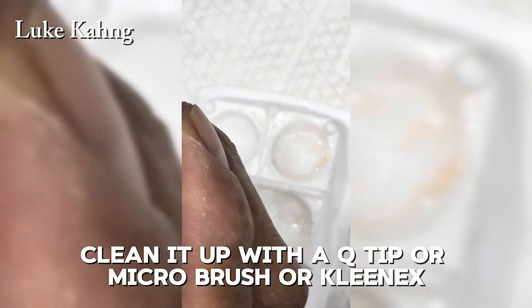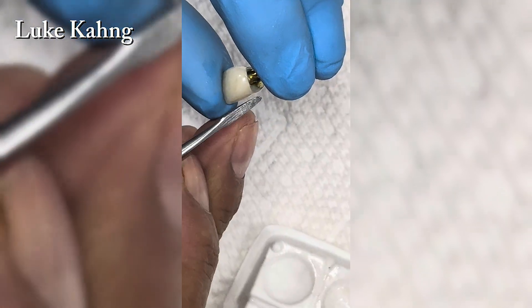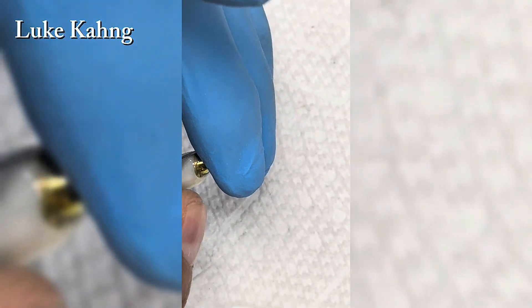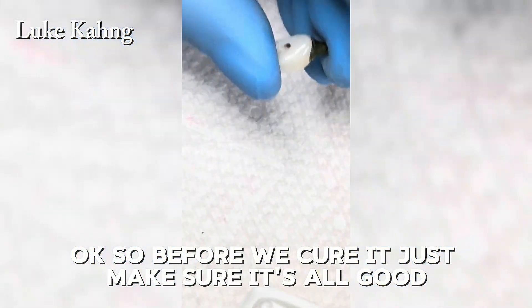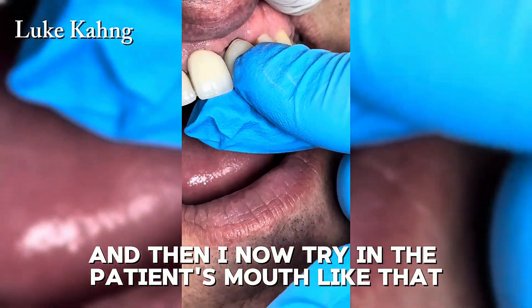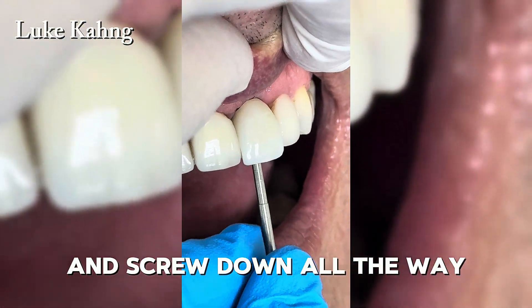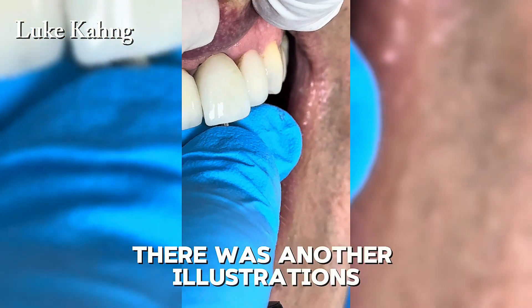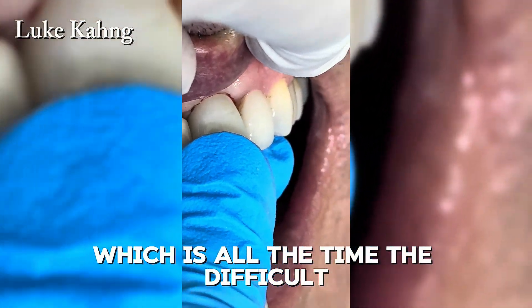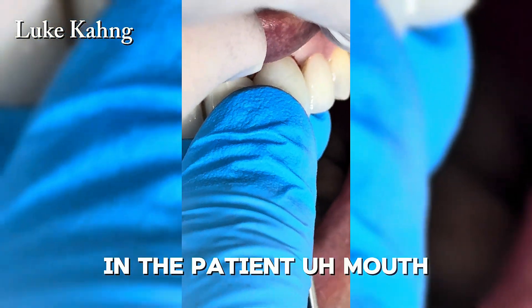Clean up the excess cement with a Q-tip, microbrush, or Kleenex to remove all cement. Before curing, just make sure everything looks good. Now trying it in the patient's mouth — the color matching is great. The tissue contour and screw retention all the way down look very good. This is the final screw-retained restoration placed in the patient's mouth, completing this fixed single implant case.